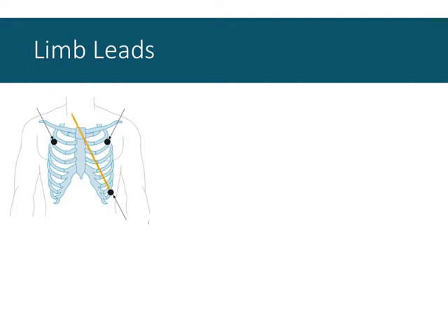But what if I combine them? And I don't mean me specifically integrating the electrical information. The ECG machine will do this. It will take a composite image of the information in lead 3 on the left and lead 2 across the chest, the average information would lie directly in the middle, along the midline between those two real leads. So I'm using the left leg as an electrode, and I'm not using another specific electrode. I'm combining information from two of them to make this hypothetical one in the middle.